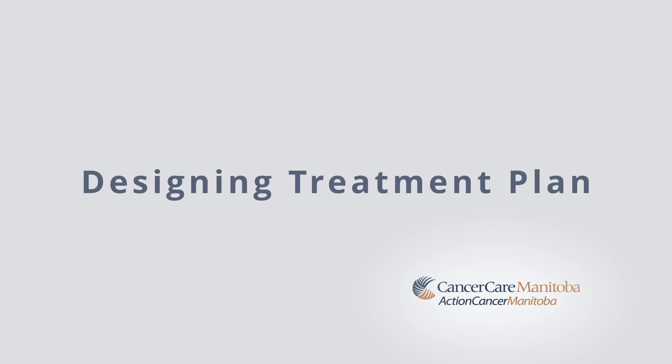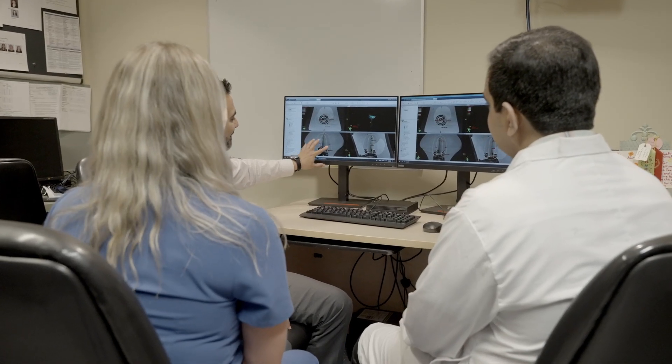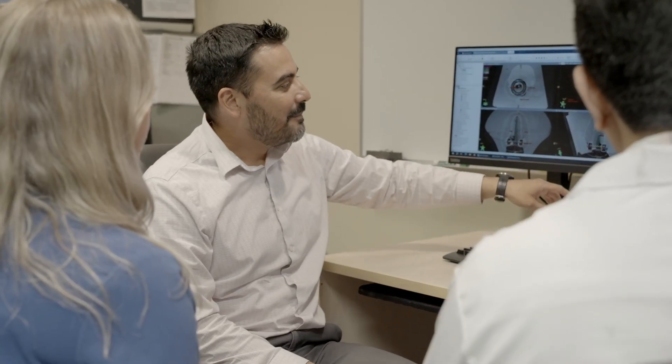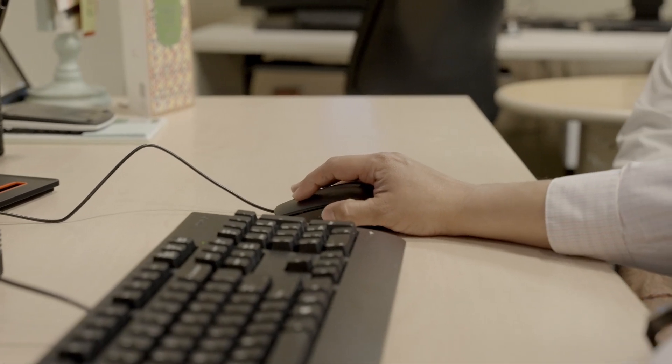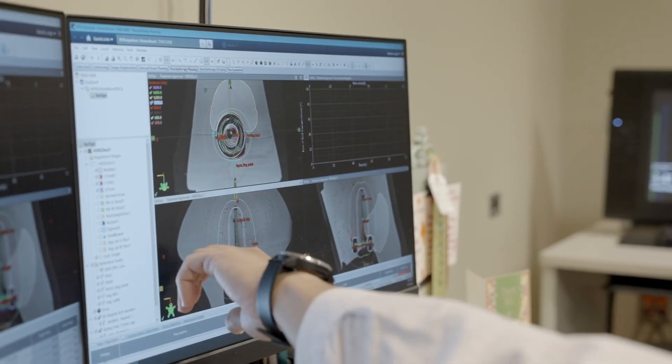The nurse will continue to monitor the patient while the HDR brachytherapy team begins the treatment planning process. Planning your treatment includes calculating where the radiation dose will be delivered and determining how much time is required to deliver that treatment. The planning process takes place in the HDR brachytherapy console area, where radiation therapists and medical physicists design the treatment plan using treatment planning software, which allows them to visualize how the radiation dose will be distributed within the body.